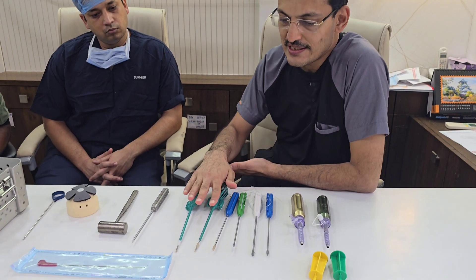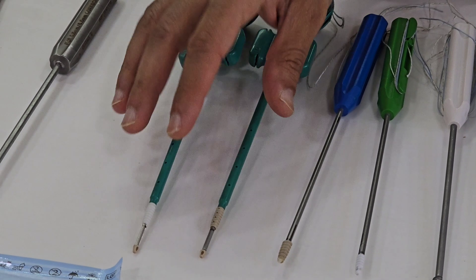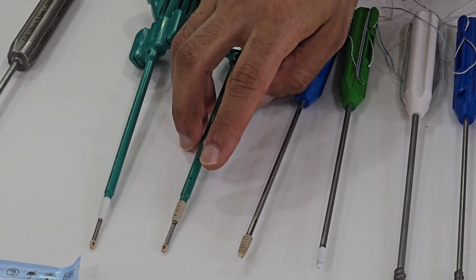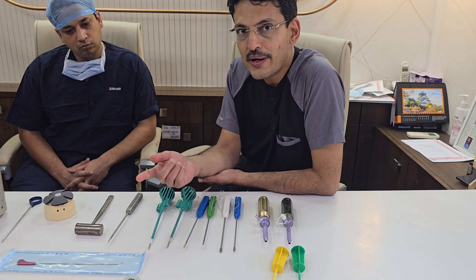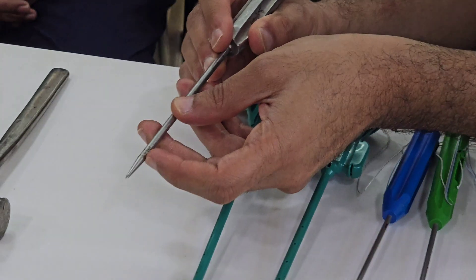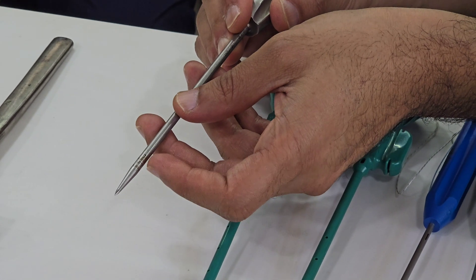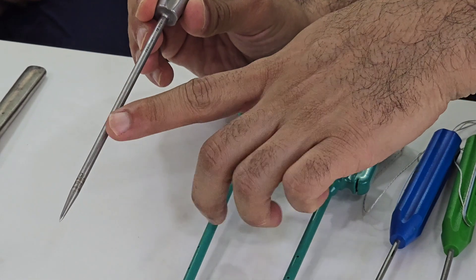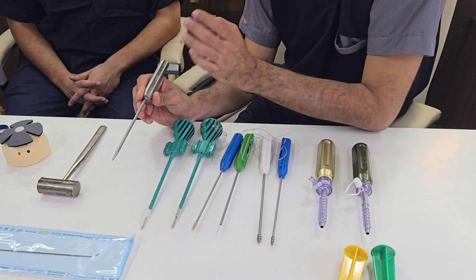Now coming to the lateral row portfolio from Arthrax. This comes in the SwiveLock range — we have 5.5mm and 4.75mm SwiveLock options, available in both biocomposite and PEEK material. If the SwiveLock has a metallic tip it becomes self-tapping; if it has a non-metallic tip, you need to prepare with the awl. This awl has two marks — the first mark is for the corkscrew insertion and the second mark is for the SwiveLock insertion. This is the universal anchor inserter, which can be used for corkscrew, biocomposite, PEEK, and SwiveLock anchors. FT is for the corkscrew and SL is for the SwiveLock.